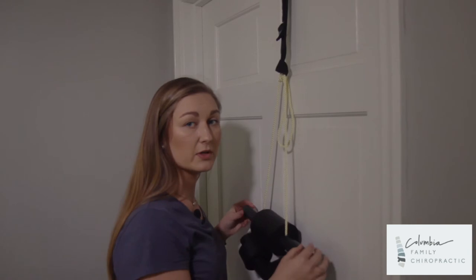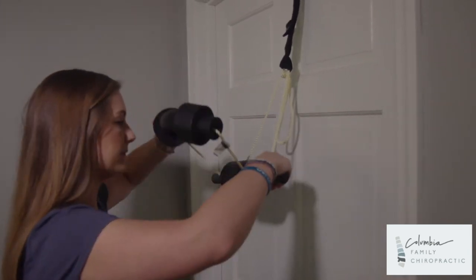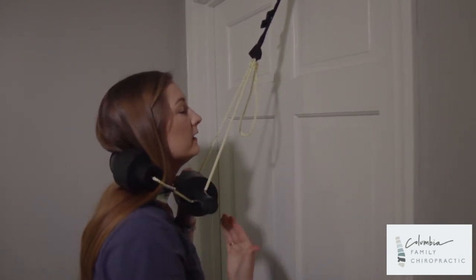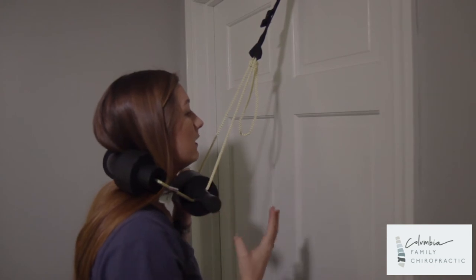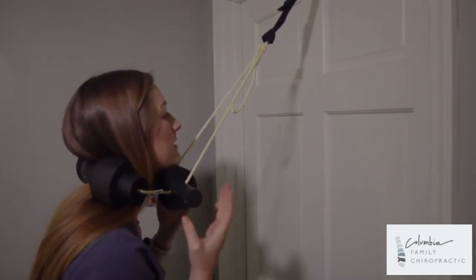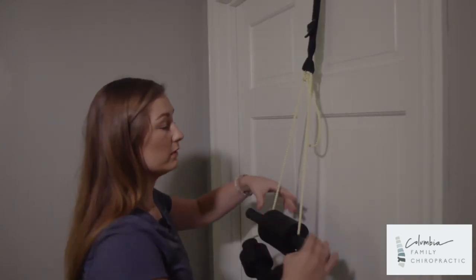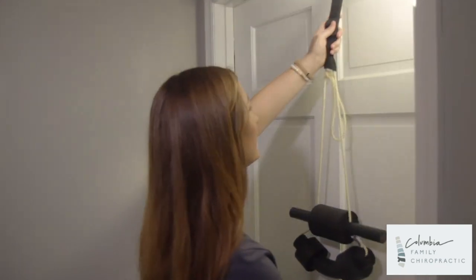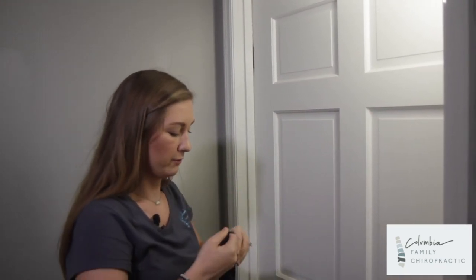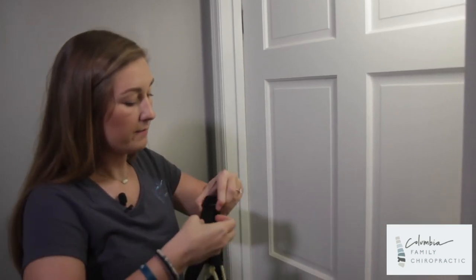It is a little low for me, so I'm going to show you two different options. First, go ahead and set this behind your neck — this part is underneath the chin. If you do have good balance, take a step back so that it tightens up slightly underneath the chin. That is option one. Option two would be to go ahead and tighten this like I showed you previously — pull this through to raise it higher so that it is better for my height.